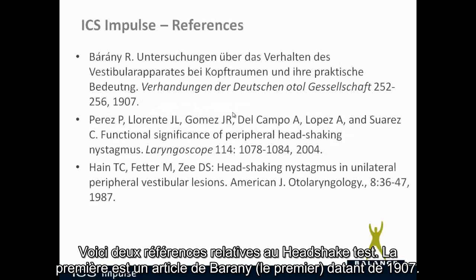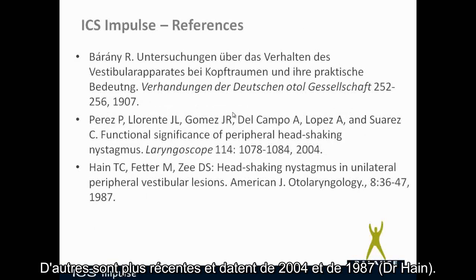And then here's a couple of references regarding head shake. The first one is from 1907, and that's the very first one, the Barany article. And then we've got some more recent ones from 2004, and then Dr. Haynes from 1987.